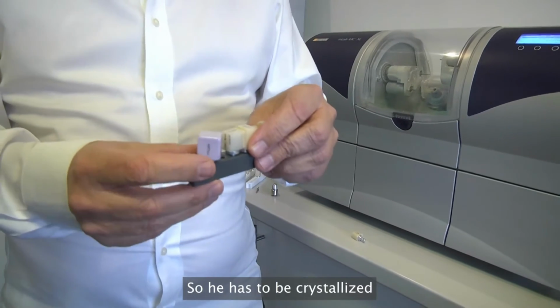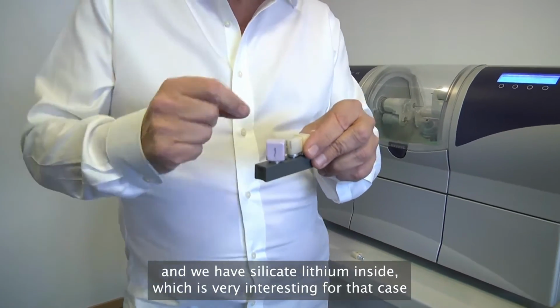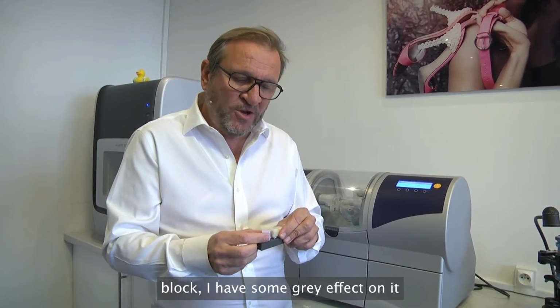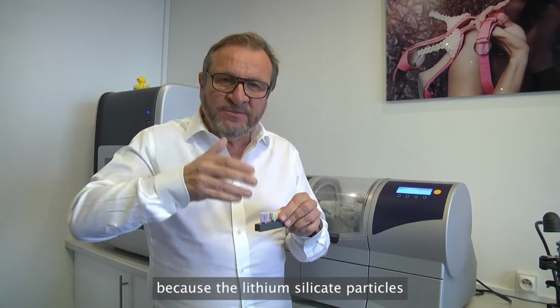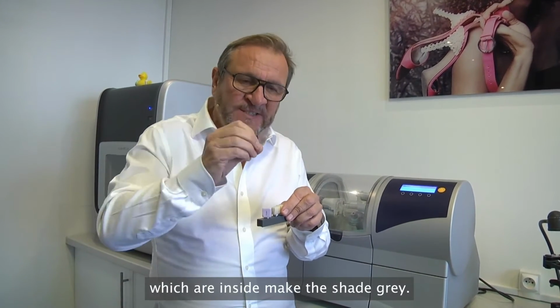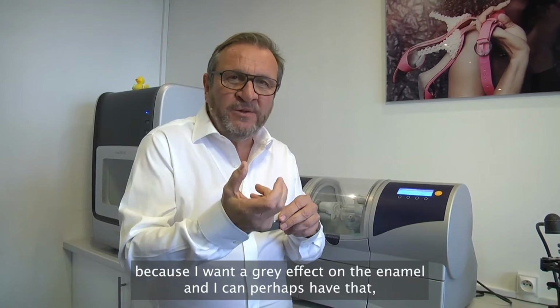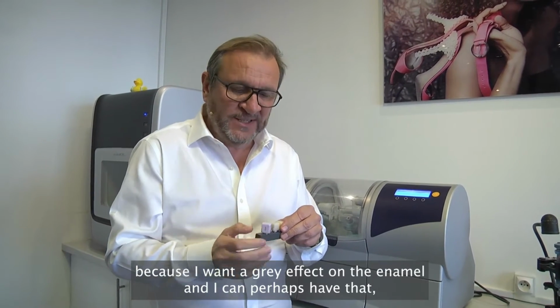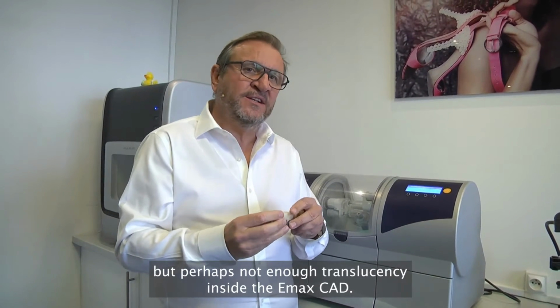It has to be crystallized, and we have lithium silicate inside, which is very interesting for that case, because sometimes when I use an Emax block, I have some gray effect on it, because the lithium silicate particles inside make the shade gray. So for that case, it could be good to use that, because I want a gray effect on the enamel, and I can perhaps have that. But perhaps not enough translucency inside the Emax CAD.